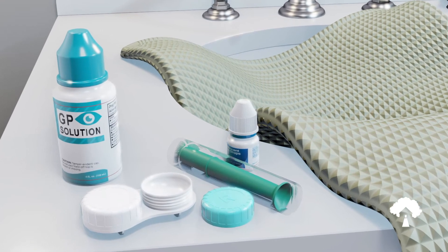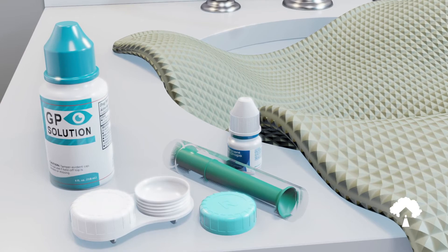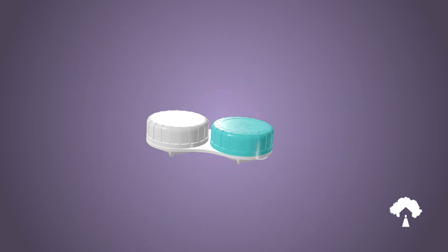Open only one side of your contact lens case so that it's ready once the lens has been removed. Opening only one side at a time helps to keep the correct lens in the correct side of the lens case.